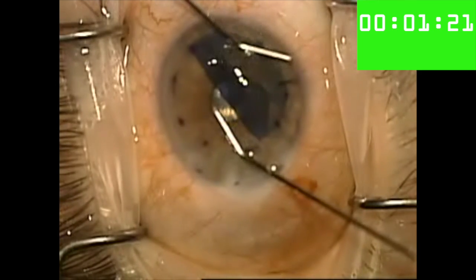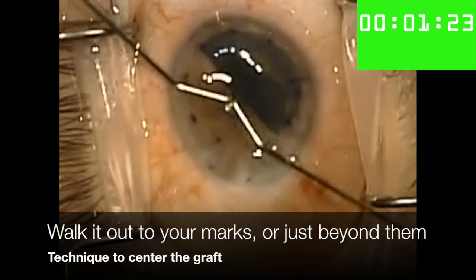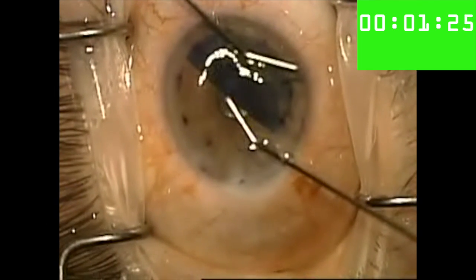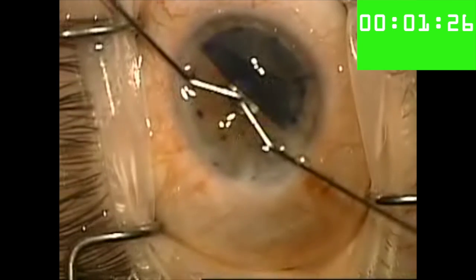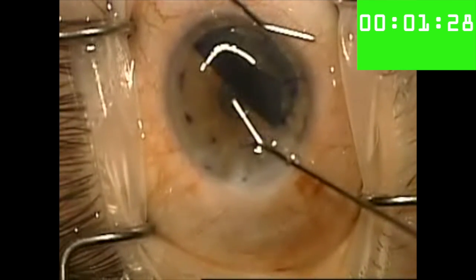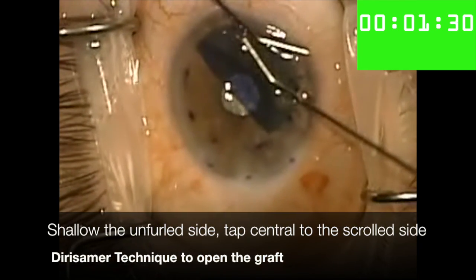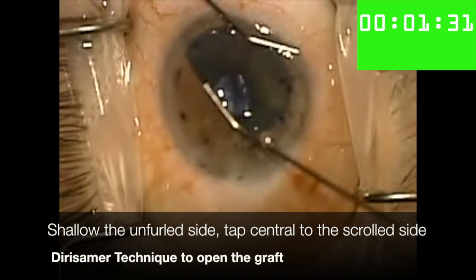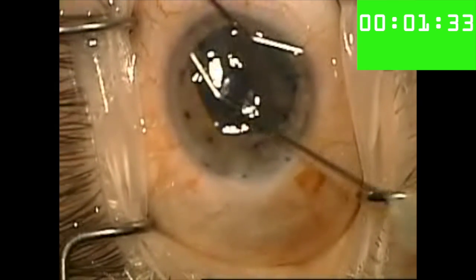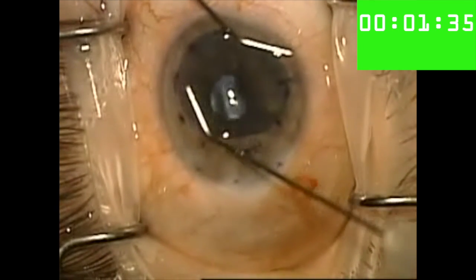I continue to walk the graft out to the periphery of the anterior chamber until the scroll's edges are a little bit beyond the marks on the cornea. This is because I expect the whole scroll to shift back the other direction when I do the derisimer technique, which I now do by shallowing the unscrolled side of the scroll and tapping central to the scrolled up side of the scroll.